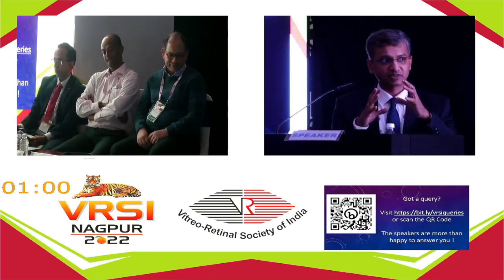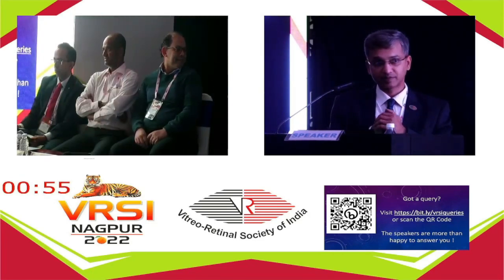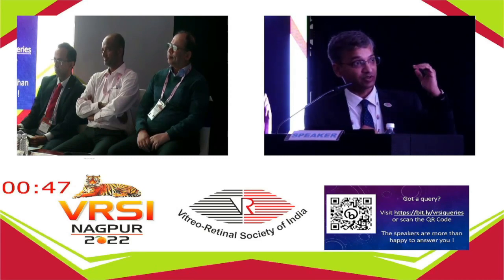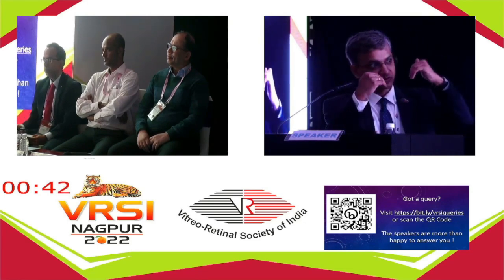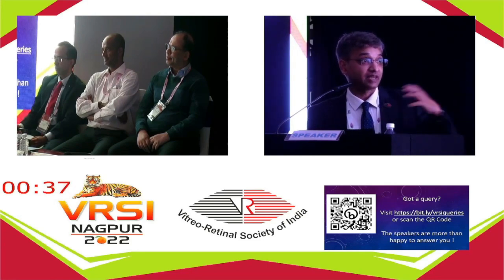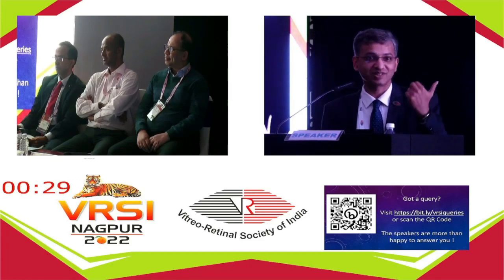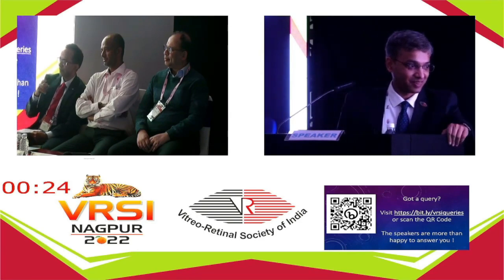We have patients sometimes who may not strictly follow the criteria which were included in the trials, who may be more susceptible to these problems. And obviously the endophthalmitis, which I talked about for PDS, the longer you follow, because an implant sitting in the sclera for a longer time, there is going to be some leakage probably, and higher risk of endophthalmitis. So, I would like to add a caveat here. I presented these, I don't have any either first-hand use experience or a trial experience. So maybe Vas, you can add more on this. Dr. Sardar.